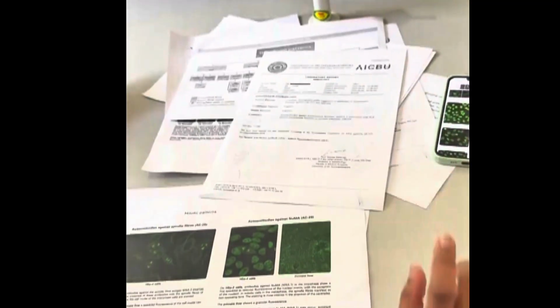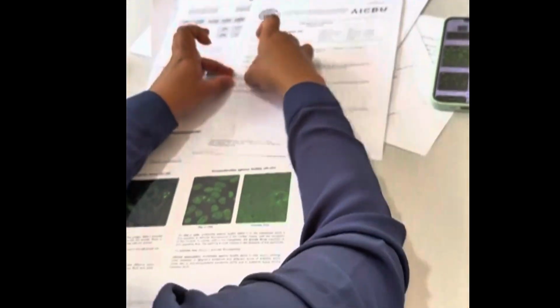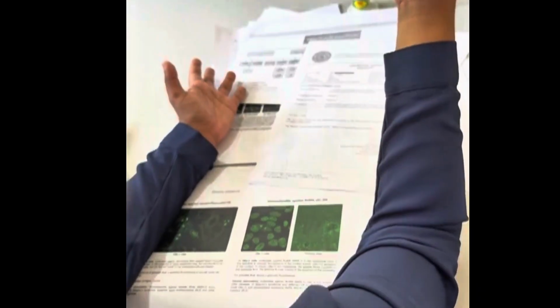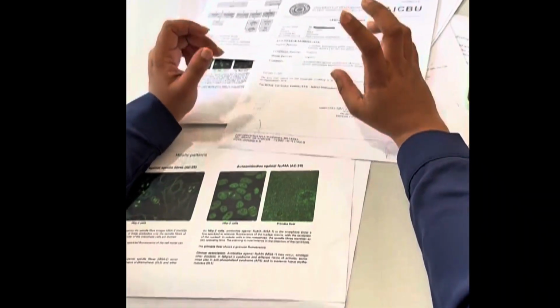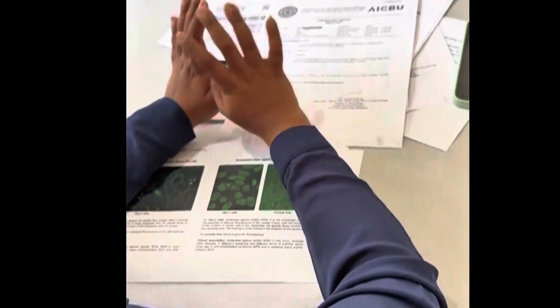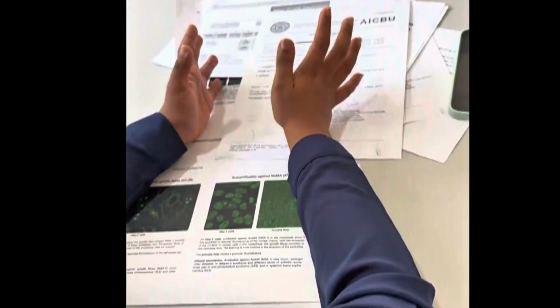We dilute the serum, so now the clinician can get a picture of what level of autoimmunity there could be in this test. There is autoimmunity, then how much autoantibody is there in the circulation? If the titer is high, sometimes the doctors specifically request the titer. If the doctor doesn't specify a titer, we just do it at 1 in 80.